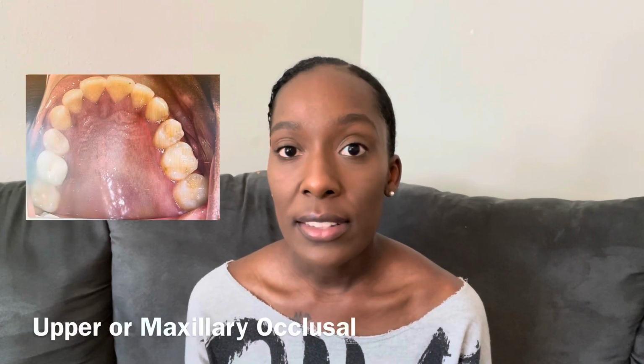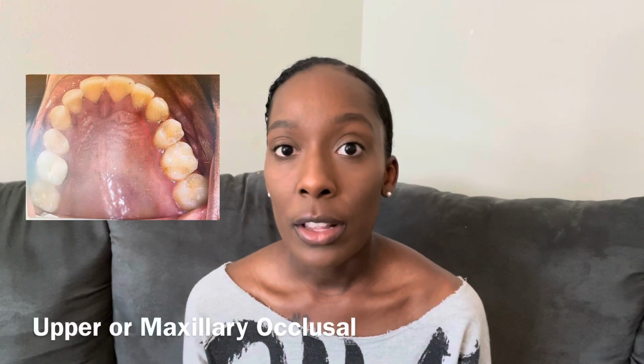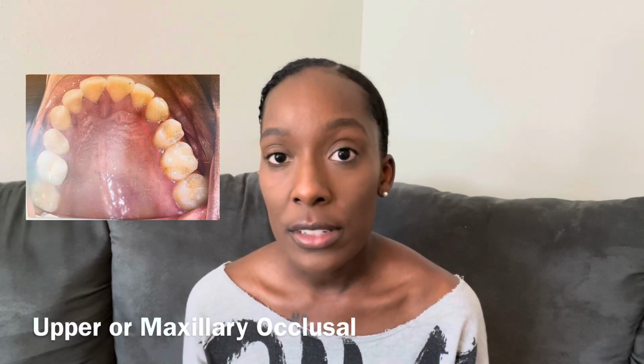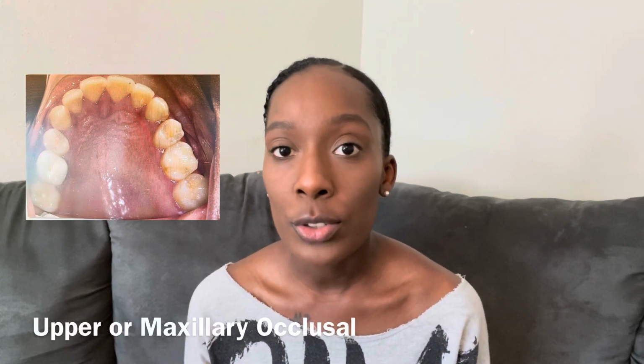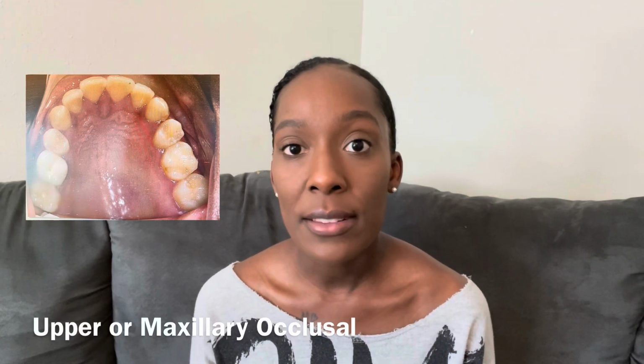The first intraoral that is taken is called the Maxillary Occlusal. And in this image, we're just looking at the upper teeth. And of course, the upper is referred to as the maxillary. And then in this image, we can see all of the surfaces of the upper. And the surfaces in dentistry and in orthodontics are referred to as the occlusal. So that's why you'll sometimes see this image titled as maxillary occlusal. And in this image, the orthodontist is looking at the upper, seeing how the upper teeth are aligned, and also looking at the surfaces of the teeth.